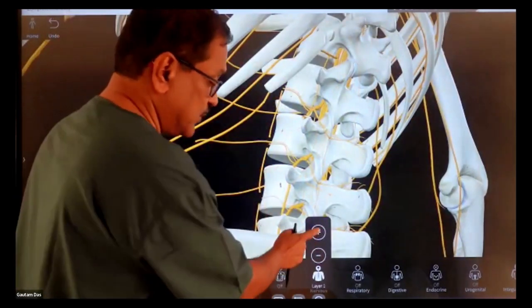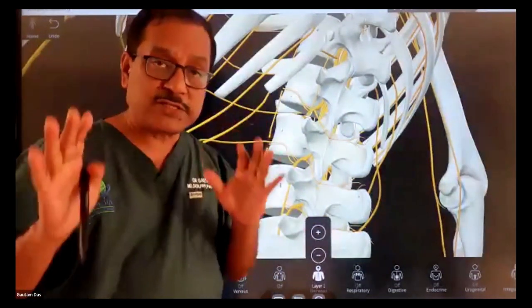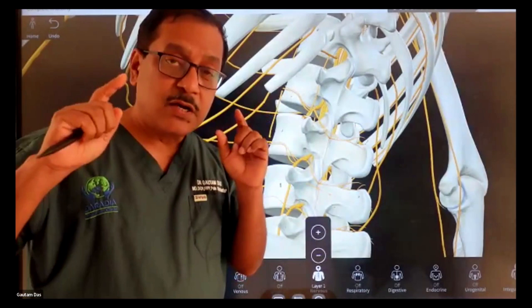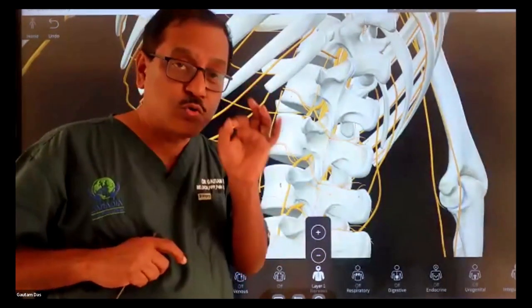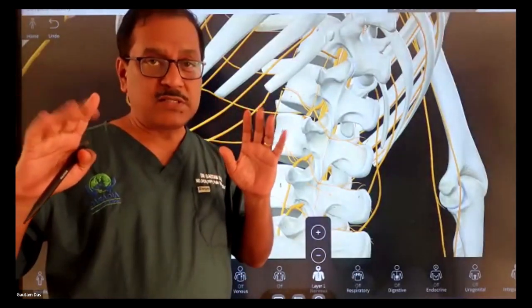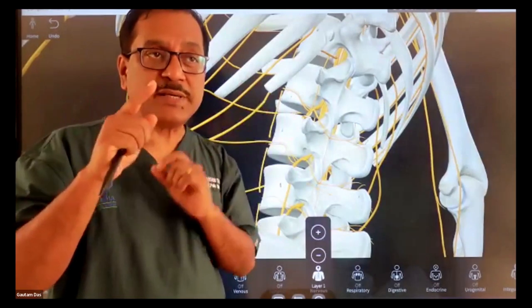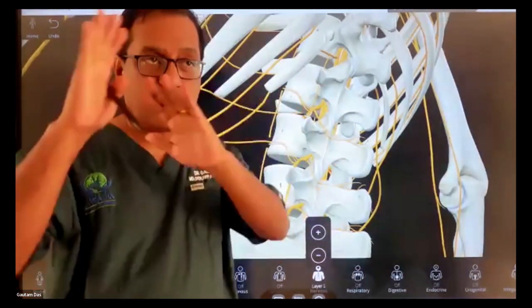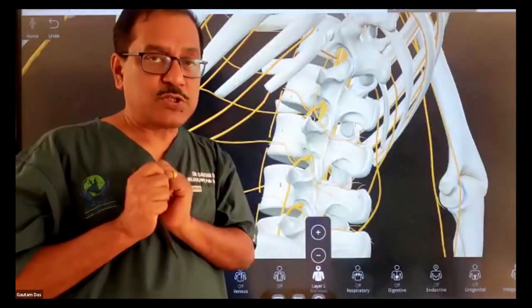So how are we going to do the procedure? First, remember this is true for all the lumbar procedures. The first step is a true AP image. How to get a true AP image? The spinous process will be at equal distance from the two pedicles. The next step is making the end plate parallel, by craniocaudal tilt. Then comes your oblique.